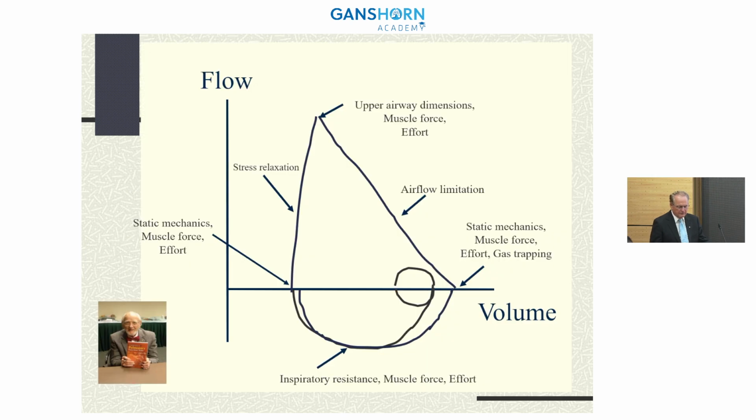that I have. Well, when we think of that maximum flow volume loop or maximum flow volume envelope, and once again, give credit to my mentor, Dr. Robert Hyatt, in his description of this, there are many mechanical and physiologic things that need to take place.